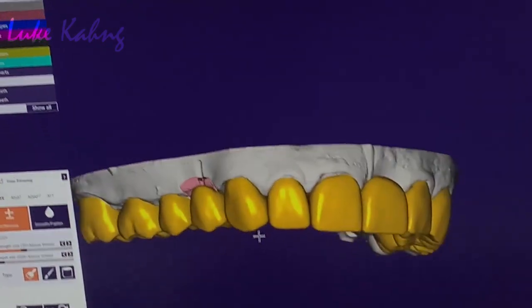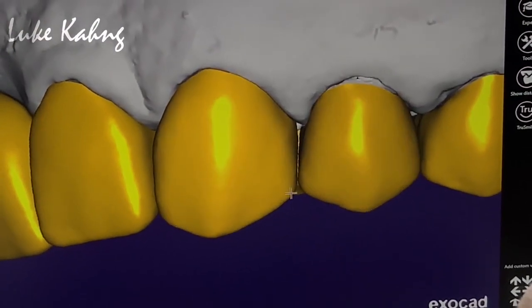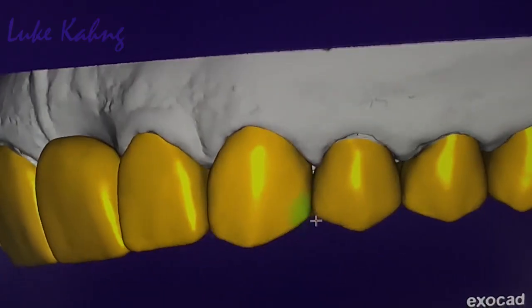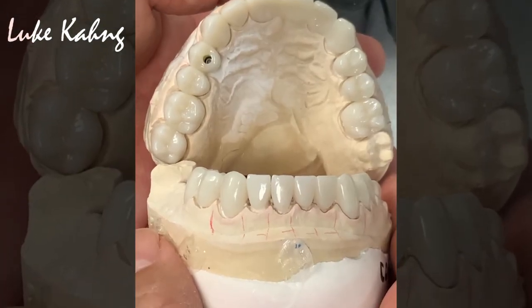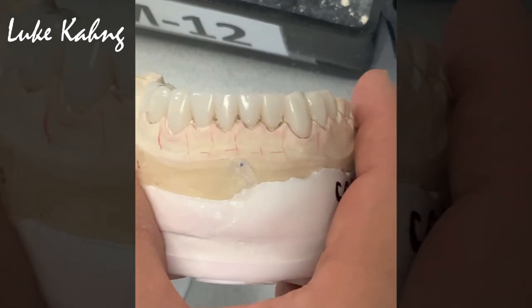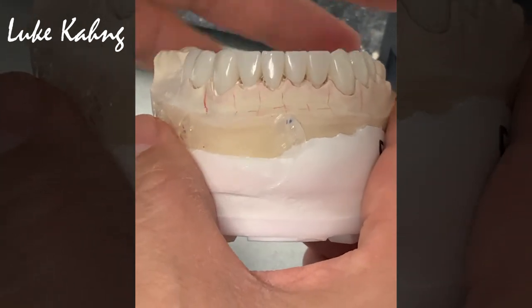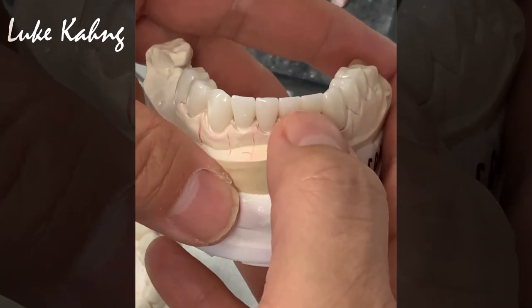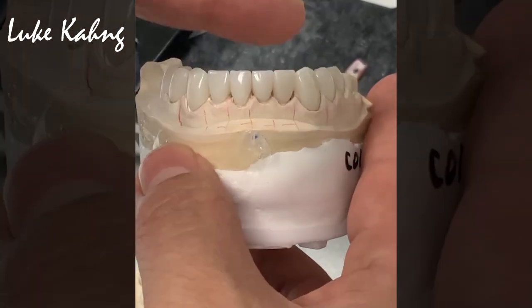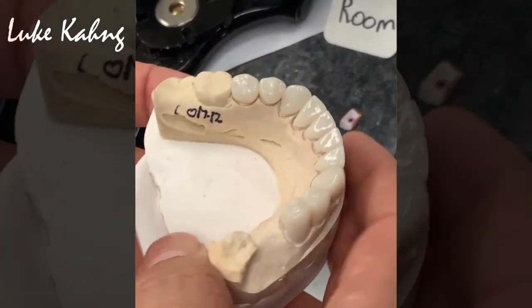So we finished the full mouth monolithic 16-unit implant bridge. This is regarding the long axis, emergence profile, height of contour, canine rise, and individual tooth contour. We finished the full mouth monolithic totally, and then we designed it. Then Joe took the video, the series video of about 9 minutes on how to set up the contour from the envelope functions, canine guidance, and then buccal corridor, height of contour, curve of Spee, and curve of Wilson. That one is to be finished completely monolithic.